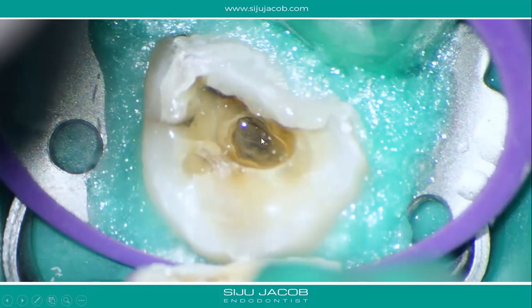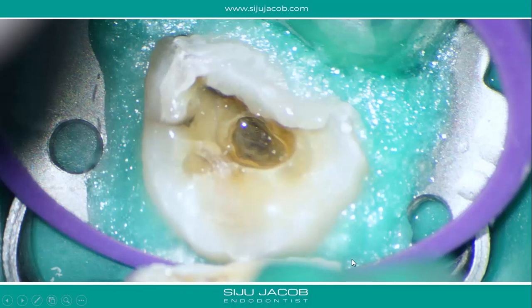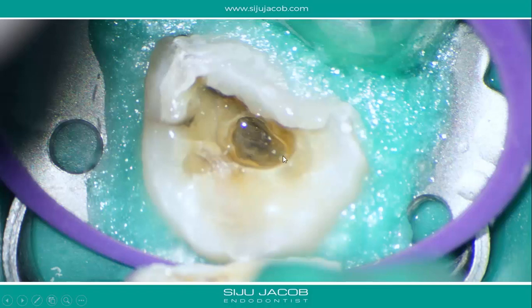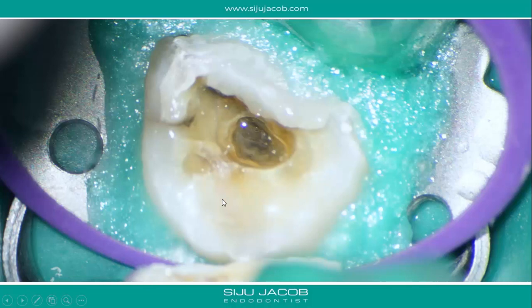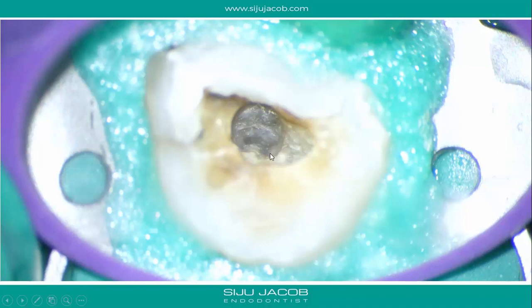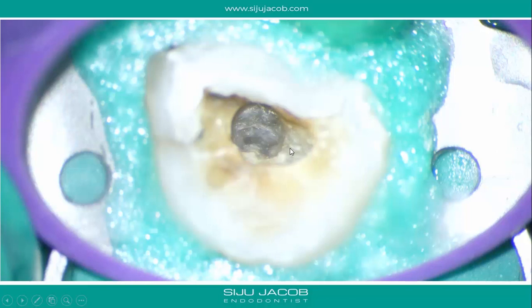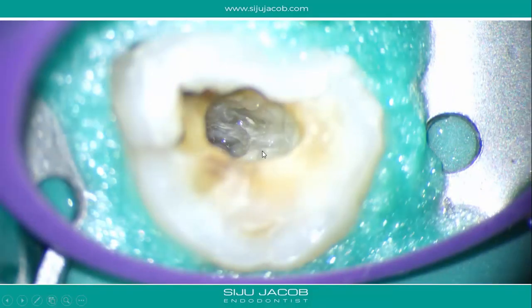As I always do, I filled the existing cavity with water to get a macroscopic perspective of the whole tooth. The cavity appeared fairly central with quite a bit of tooth structure both palatally and buccally. Once we had that information we dried it out and decided the first step was to remove the calcified portion — you could see a calcified pulp chamber — to see what was underneath.